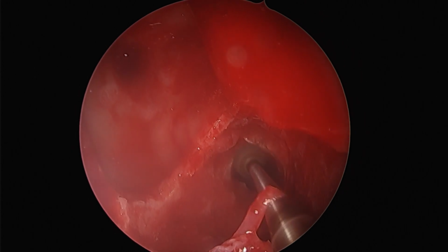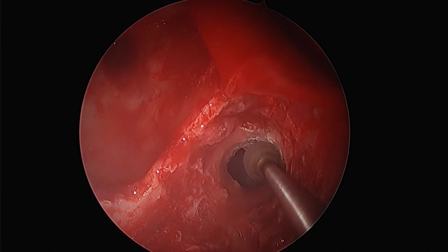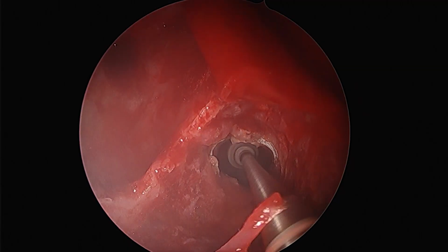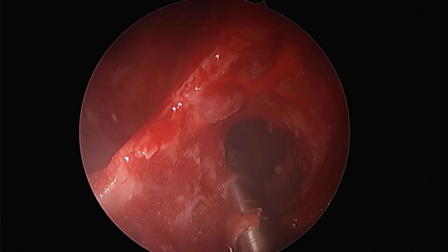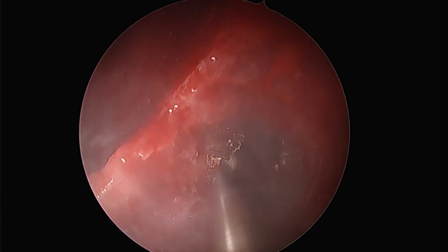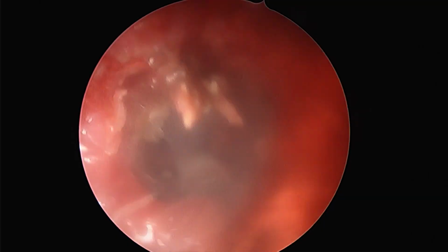Now we understand that the drilling can obviously ensure a thick fibrotic reaction in the post-operative period. So we make sure to widen this sphenoid ostium or anterior face of sphenoid liberally, so that it does not get stenosed following an excessive fibrotic reaction that normally happens post drilling of the bone inside the sinuses. We are using a diamond burr here.